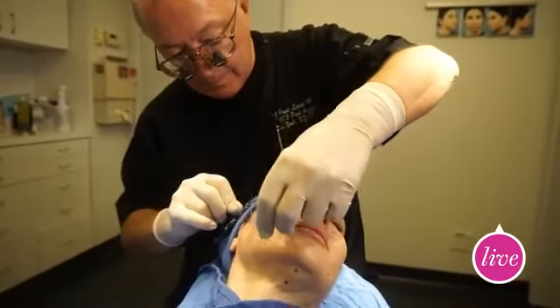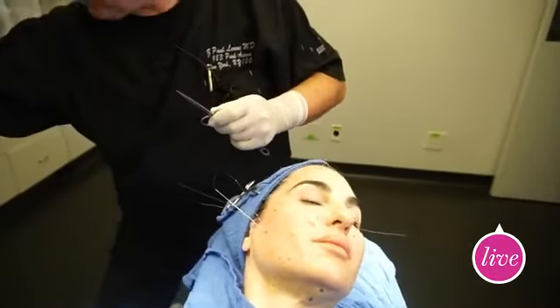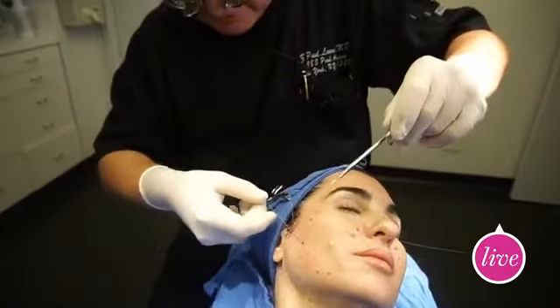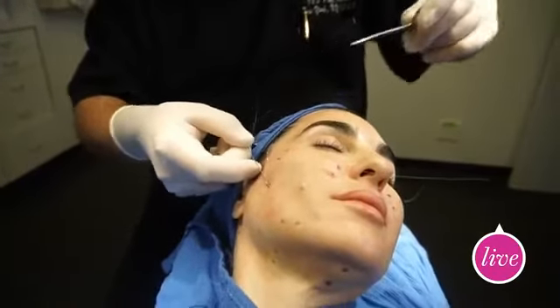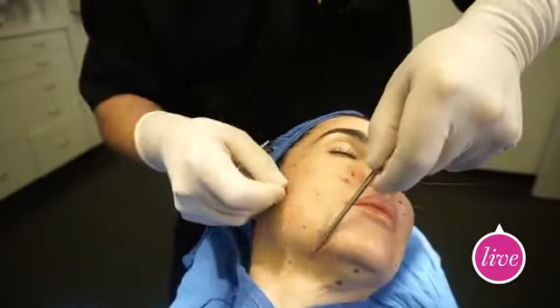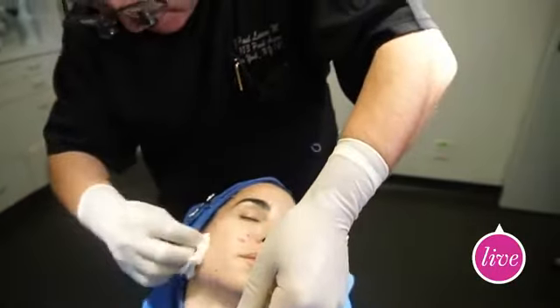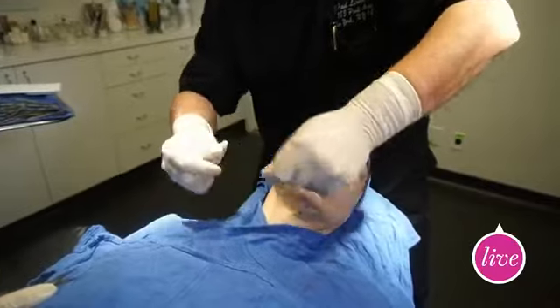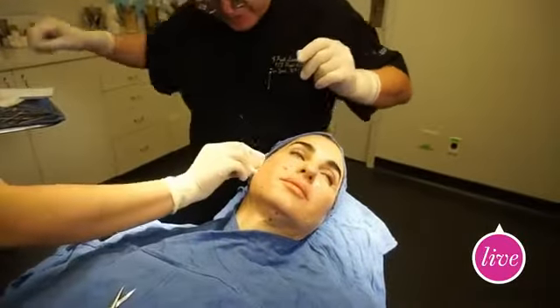And now people want you to explain again what you're doing. So with the needle, the one that you put in first, that's a cannula, correct? The first needle is an 18-gauge needle that introduces or makes a hole, through which I put the 23-gauge needle, which you see right here. It glides underneath the skin in the fatty tissue, in the subcutaneous tissue, like a cannula. It's not a cannula, it's a needle. As you can see, it comes out through the skin. But it's not a cannula because it's not blunt, it's sharp. And we're just moving along. We are on number 4, I think, at this point.